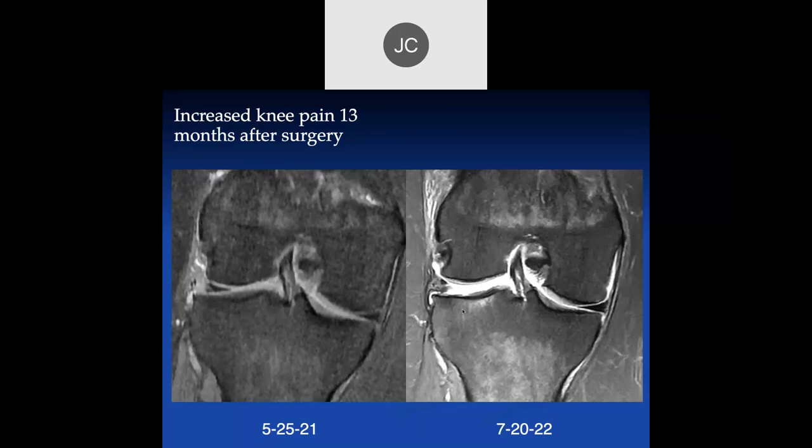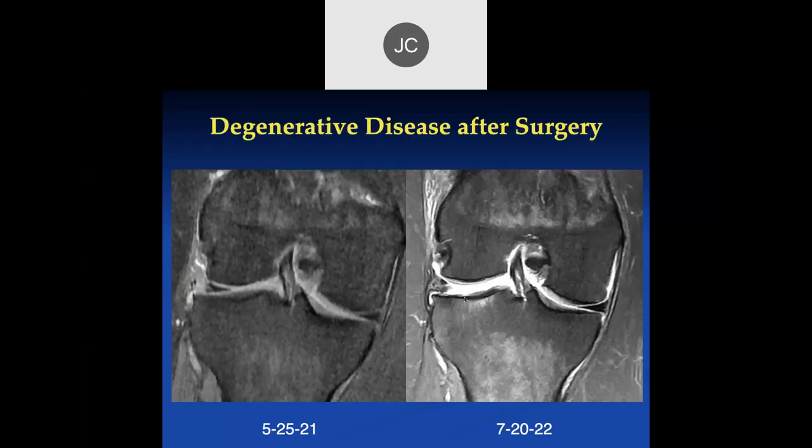And if I was to guess, this knee is unstable. Yeah, this is a large amount of meniscus removed, so the patient is going to have some instability because you no longer have the meniscus there to properly stabilize the knee. And we think that's what leads to a lot of the degenerative changes which occur.